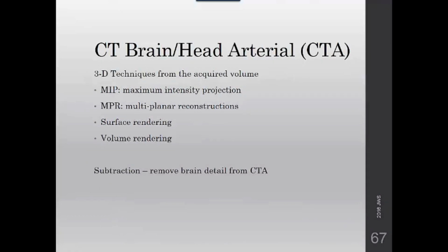3D techniques are required and are performed with those acquired data as well. You're going to use MIPs, MPRs, surface rendering, and volume rendering. You can pull out all the stops with these CTA brains to turn into the radiologist. You can have some really pretty studies.